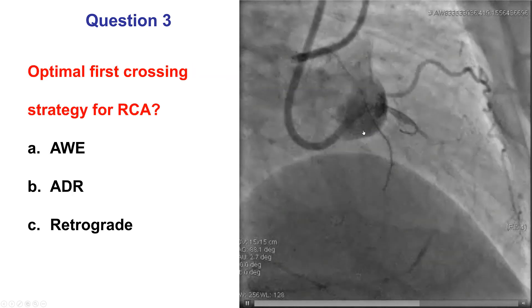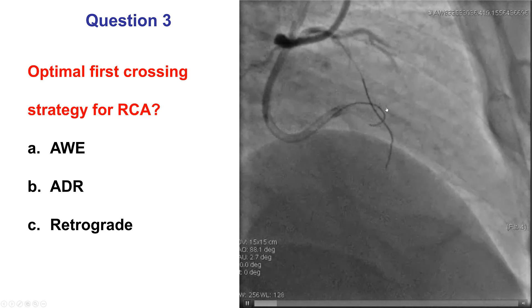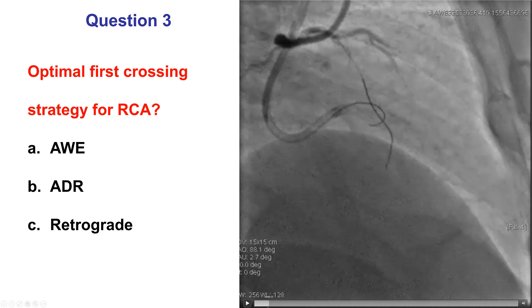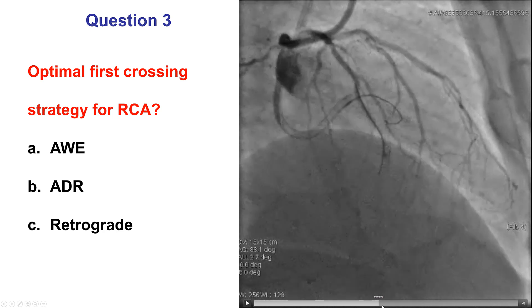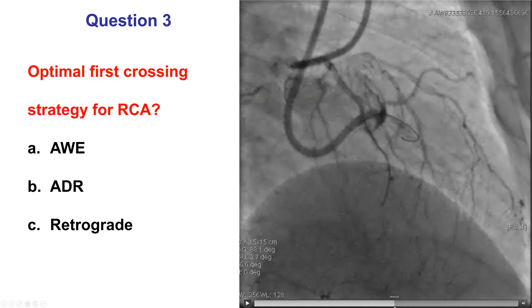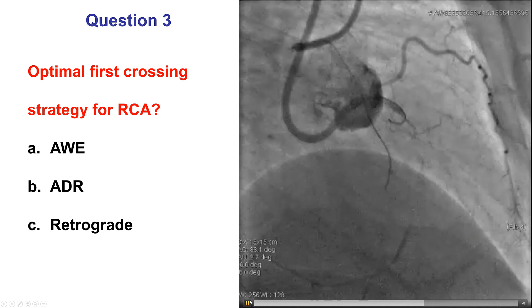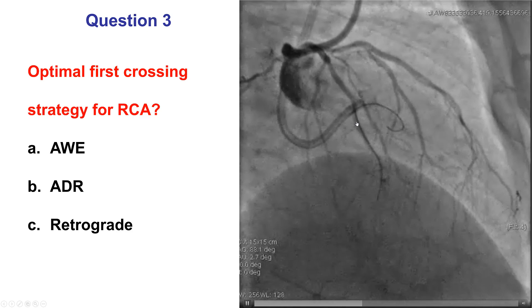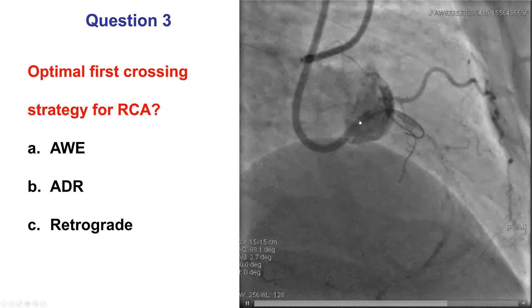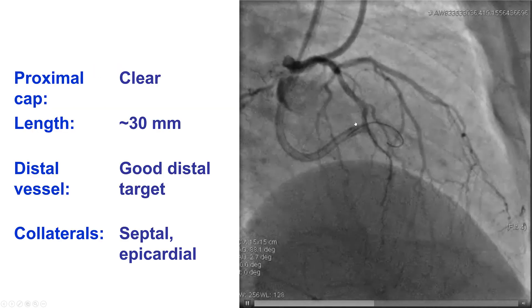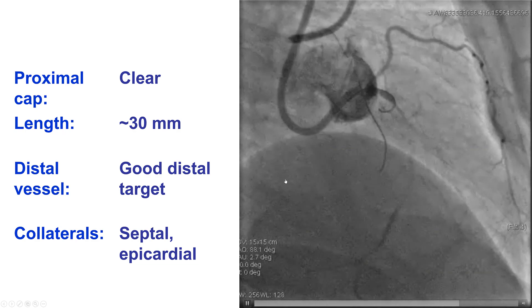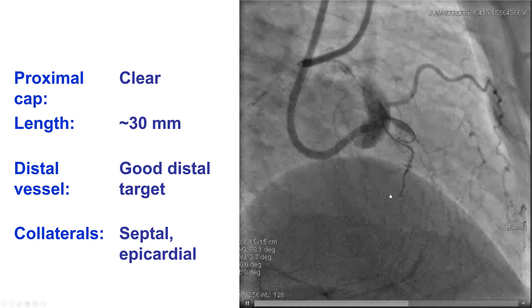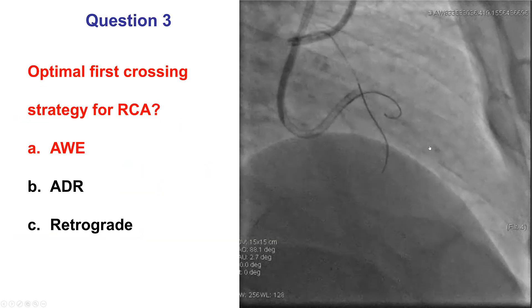Here is a lateral view of the right coronary artery. We have a CTO with a well-defined proximal cap. There are small branches — an acute marginal branch — but there is a well-defined proximal cap. We have an Amplatz 1-type catheter and a well-defined proximal cap with a length of 30 millimeters. The distal vessel appears to be in good quality, and there were septal and epicardial collaterals, but we decided to first do an antegrade crossing attempt.